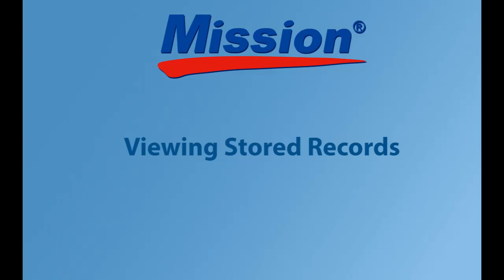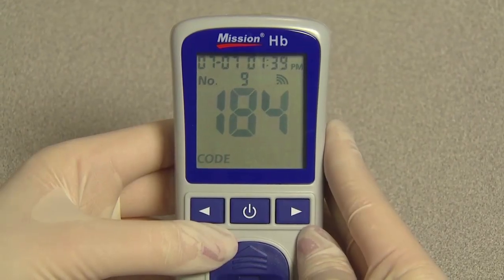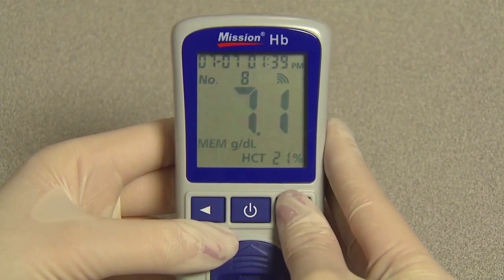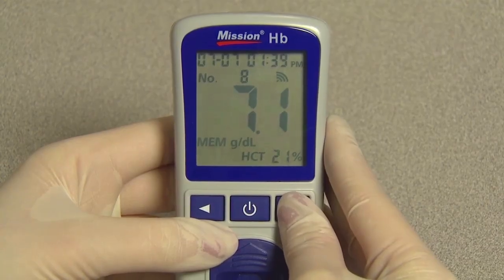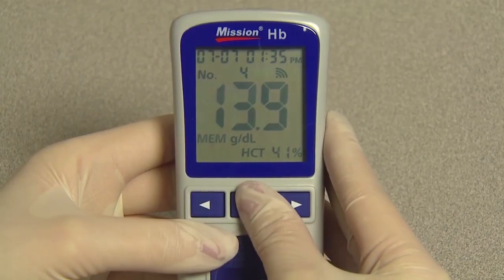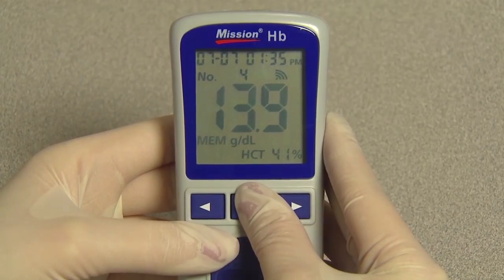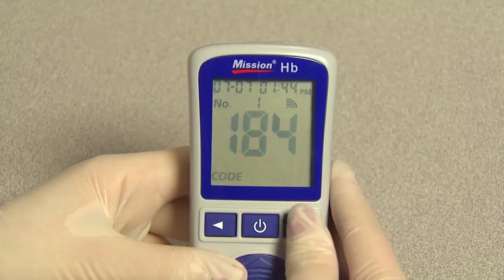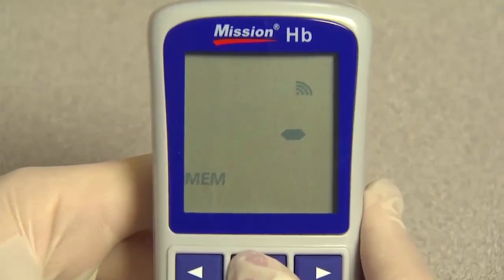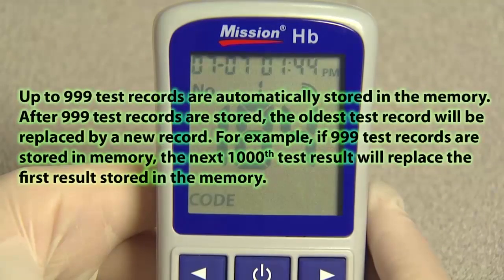Viewing stored records. To view stored records, from the initial screen press right or left to show the first record. Press right or left to view each record in date, time, and sequence order. Press and hold the power button to return to the initial screen. If no data is stored, the meter will display one dash and MEM. Up to 999 test records are automatically stored in the memory. After 999 test records are stored, the oldest test record will be replaced by a new record.